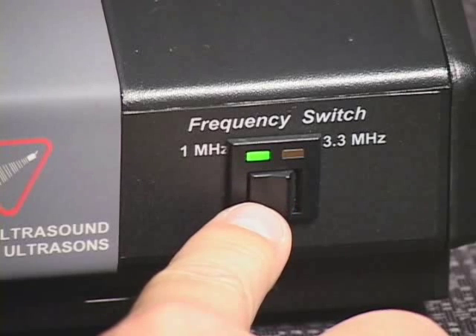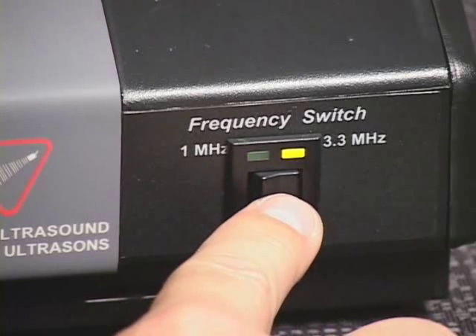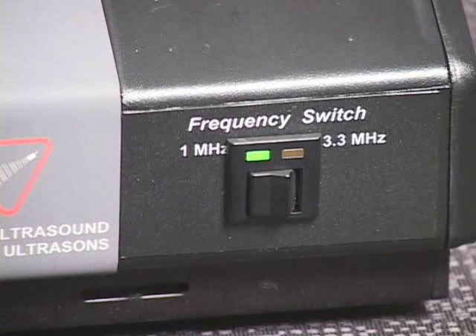If the ultrasound generator is equipped with the 1 or 3.3 MHz output frequency option, set the ultrasound frequency switch to the desired ultrasound output frequency. When the ultrasound frequency switch is in the left 1 MHz position, the green ultrasound frequency indicator light, located on the upper left corner of the ultrasound frequency switch bezel, will illuminate and ultrasound output frequency of 1 MHz is selected.